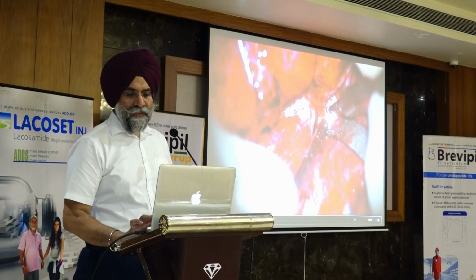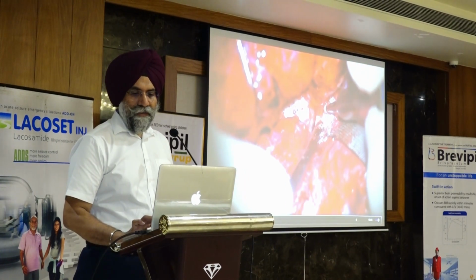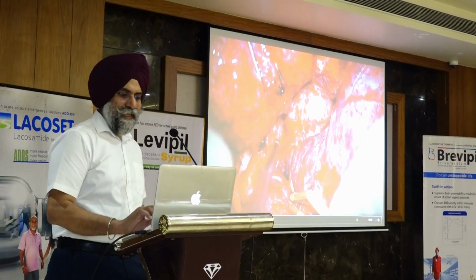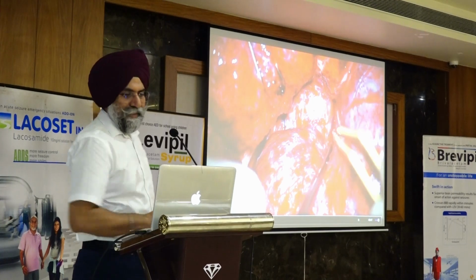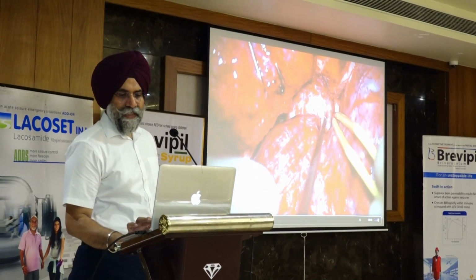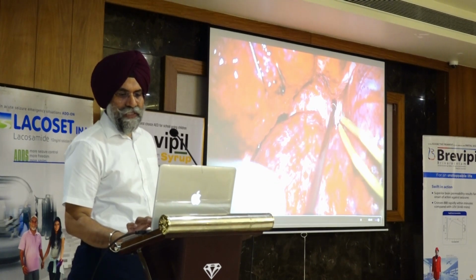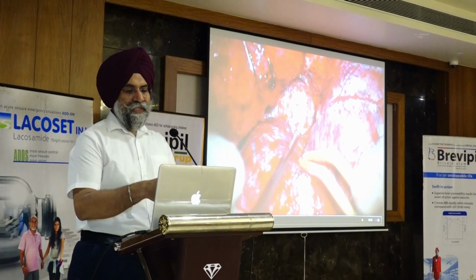So this is just clearing the little bit of bone over the optic canal. Now you see that the whole of the temporal lobe is lifted off the cavernous sinus, right? This is the optic nerve with the sheath, and this is the third nerve, which is stretched out very clearly, and this whole tumor is in the cavernous sinus. Now you see that everything is extradural.